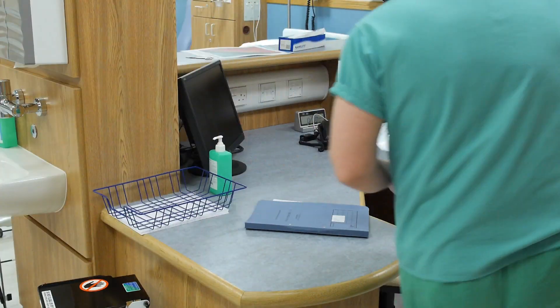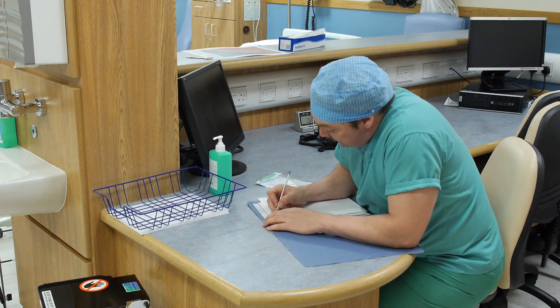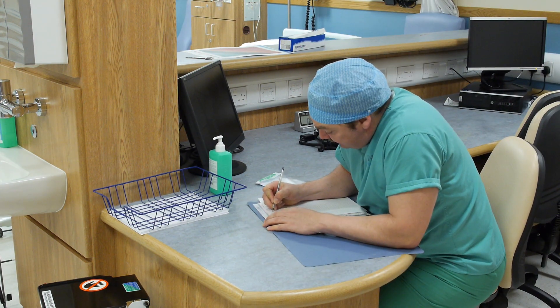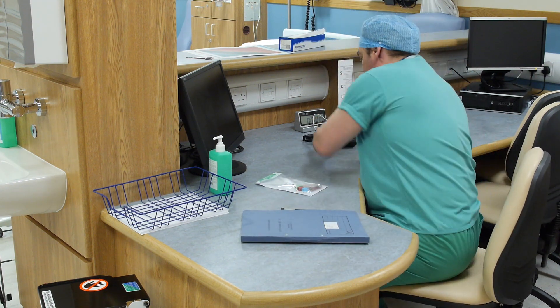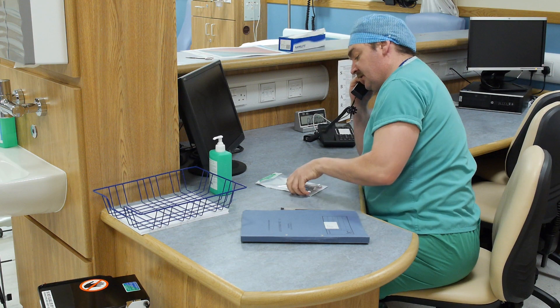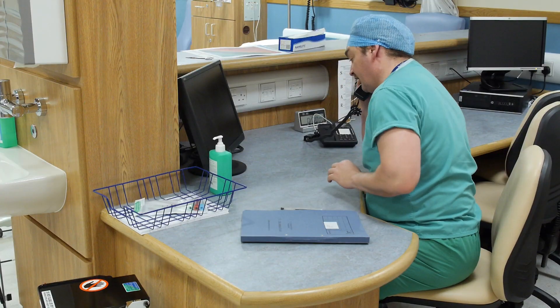Follow the hospital procedure for collection and transportation of specimens to the laboratory. Record the date, time and site of the venipuncture and any tests undertaken in the patient's notes. Finally, it is crucial to ensure samples reach their destination to be analysed.